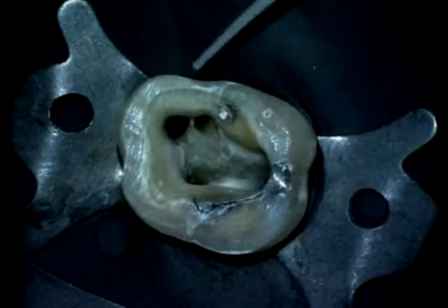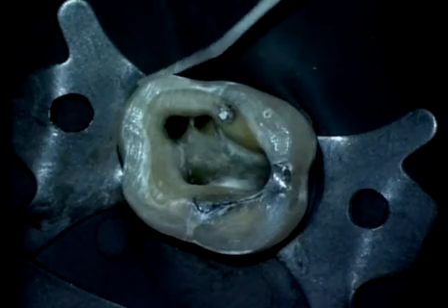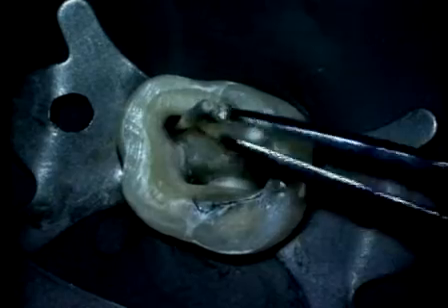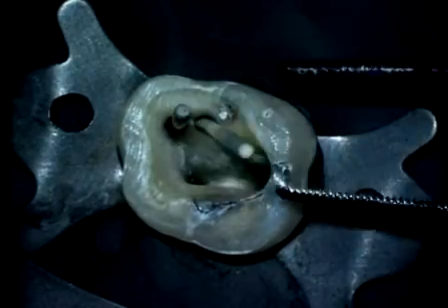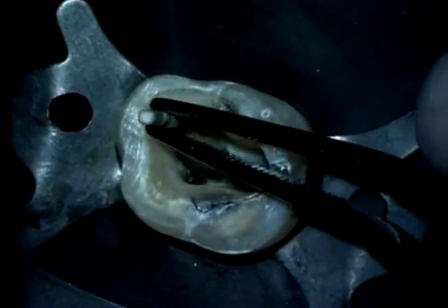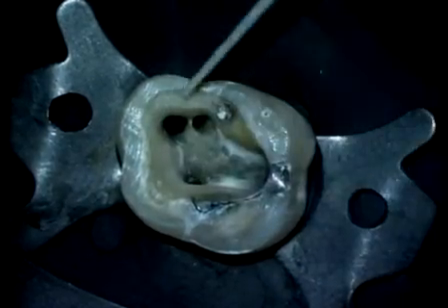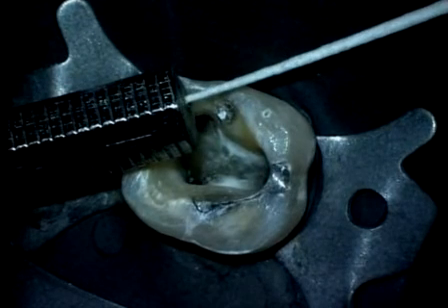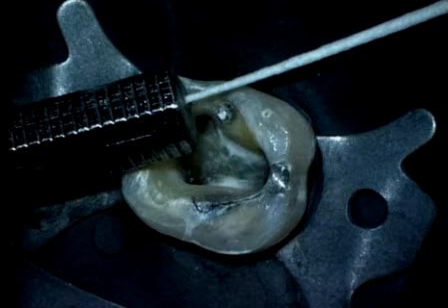We can inspect the terminal extent of the paper point to judge the drying process. Ultimately, we want our paper points to be dry right to the physiologic terminus. We can inspect this point very precisely by looking carefully at the terminal extent of the paper point. That part of the paper point that is just a little bit soft represents that part of the paper point that's minutely beyond the foramen.